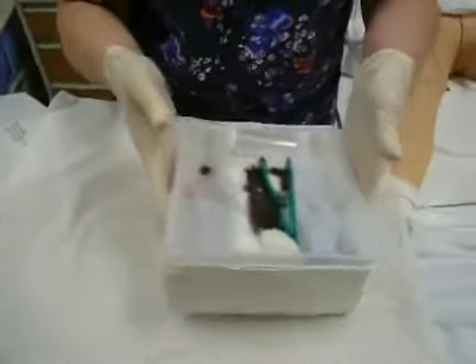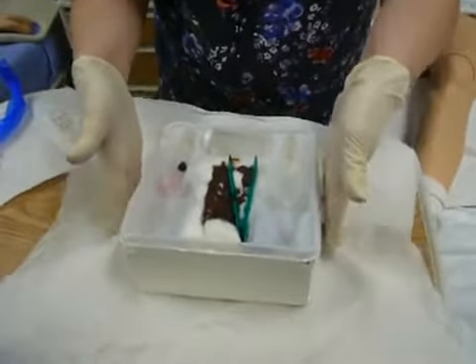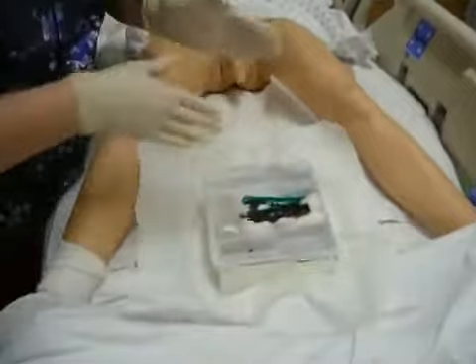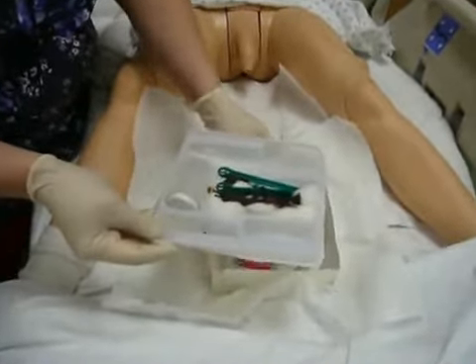Now I'm going to put these back together so that I can move the sterile field to the bed. When you move your sterile field, you come in from the sides with your fingers, making sure you maintain that 1-inch border, and I'm going to slowly bring it over and place it down between his legs on the bed. Now, it looks exactly like the female cath insertion that you saw before.